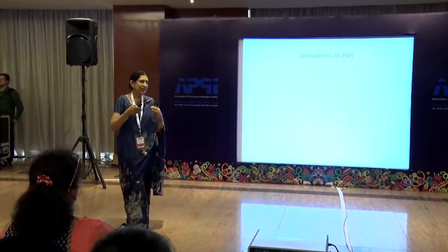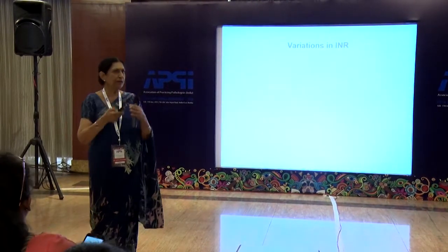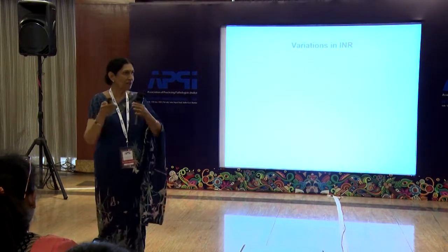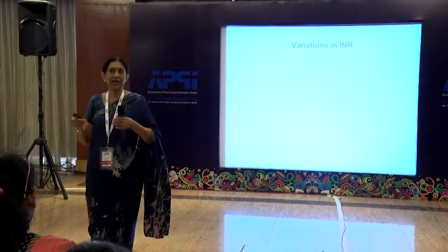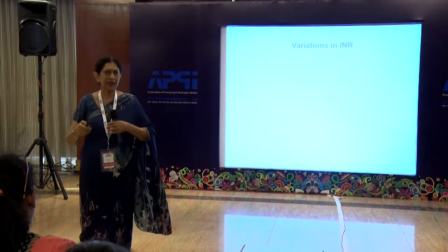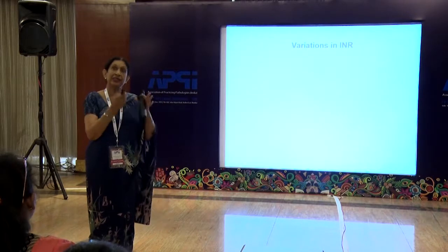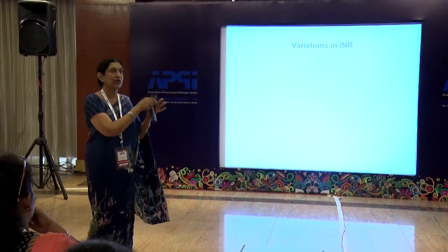One person gets a prothrombin done in my lab every time. He's on warfarin, very beautifully controlled, 2.5 INR, perfect. We are happy. He goes traveling to his daughter in Nasik, and after a month gets another prothrombin time done there. Oh, 1.5? Mine had come 2.5 there just now. Either this one is wrong or that one is wrong. Neither is wrong. You have been standardized with that reagent, with that method of testing clot, and with those conditions or method of doing.